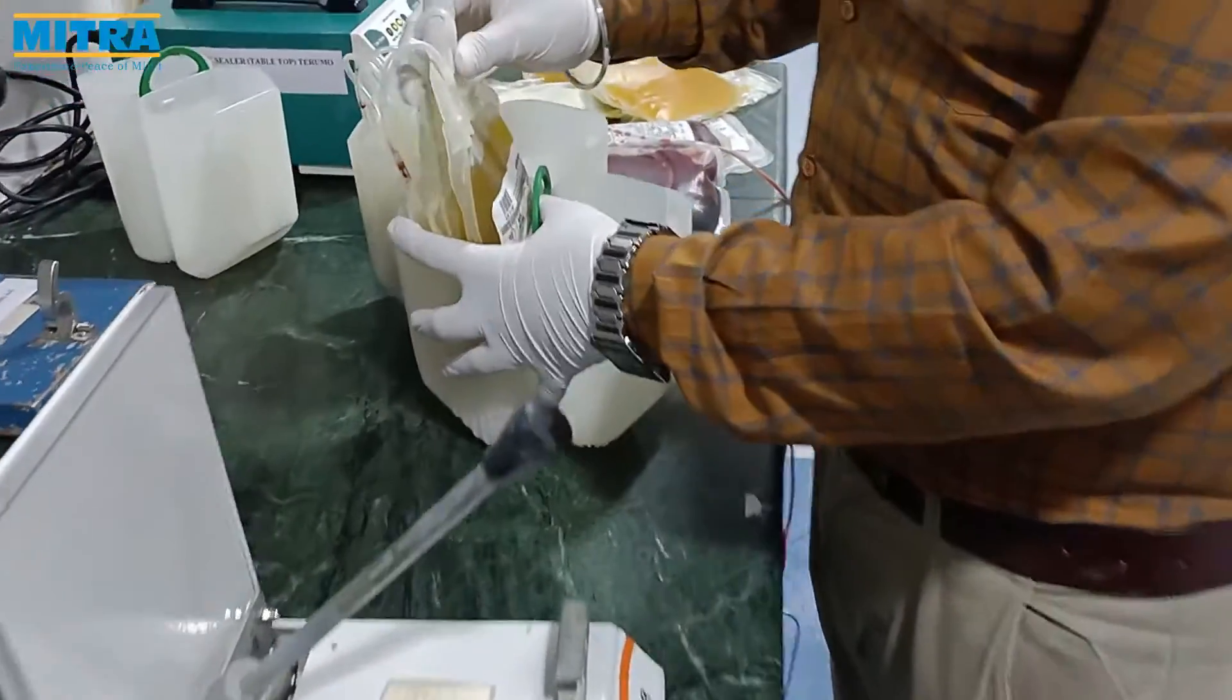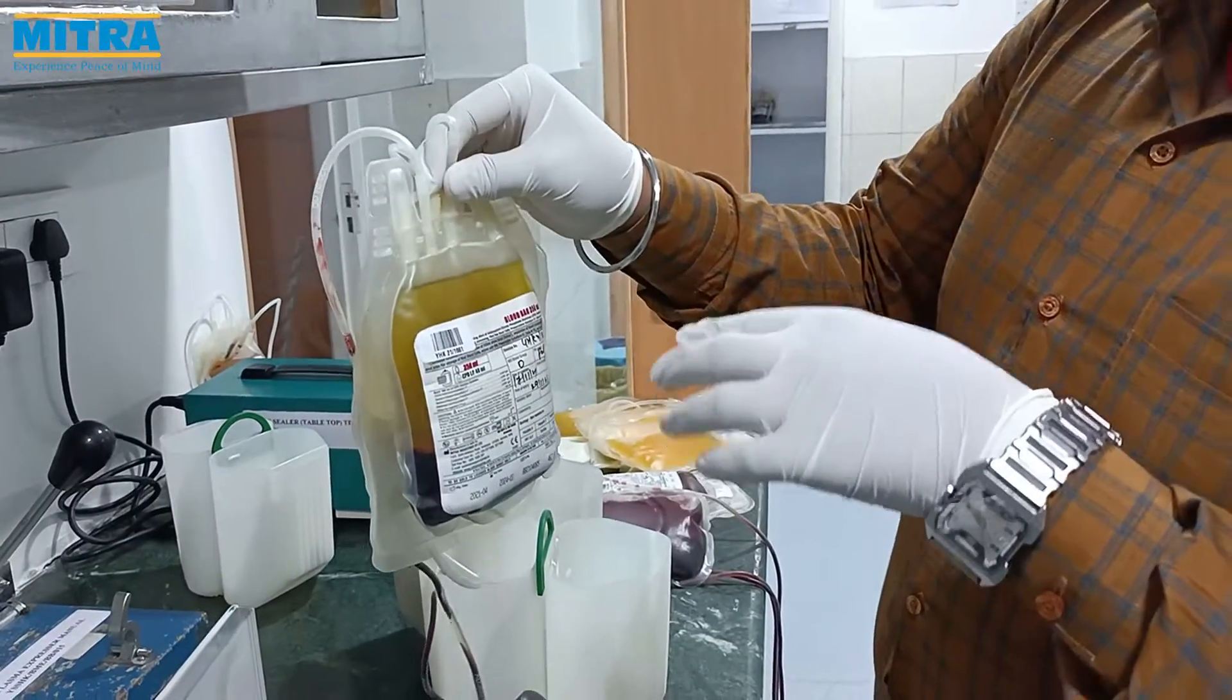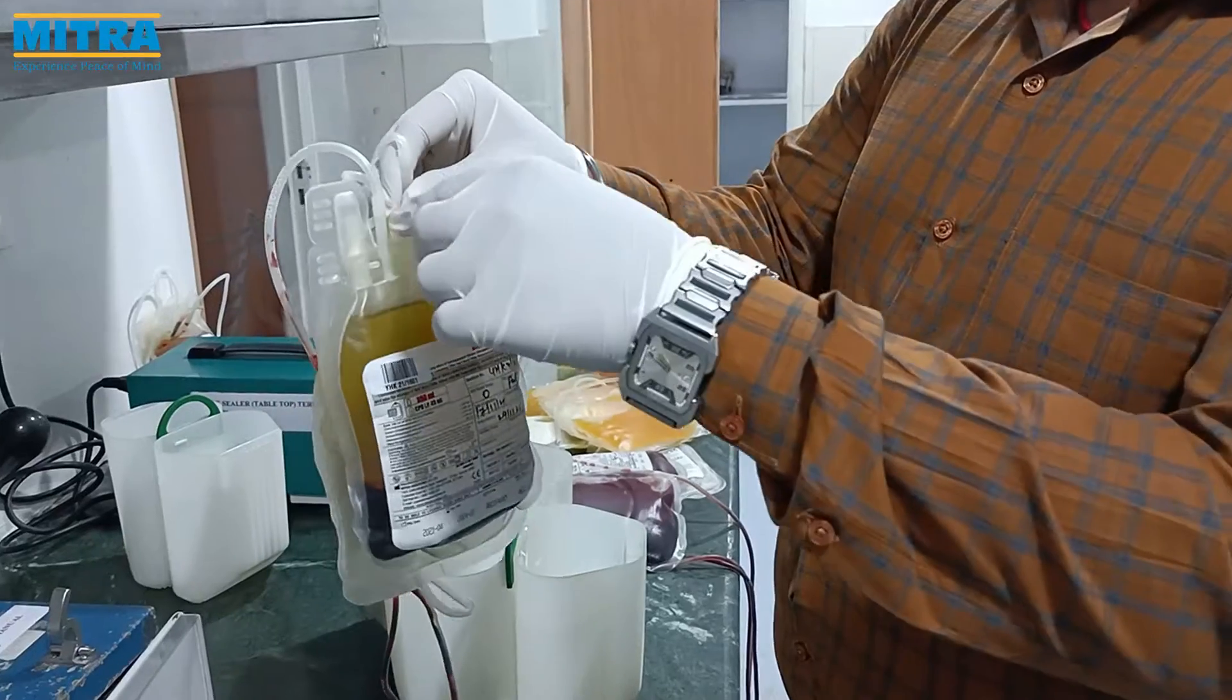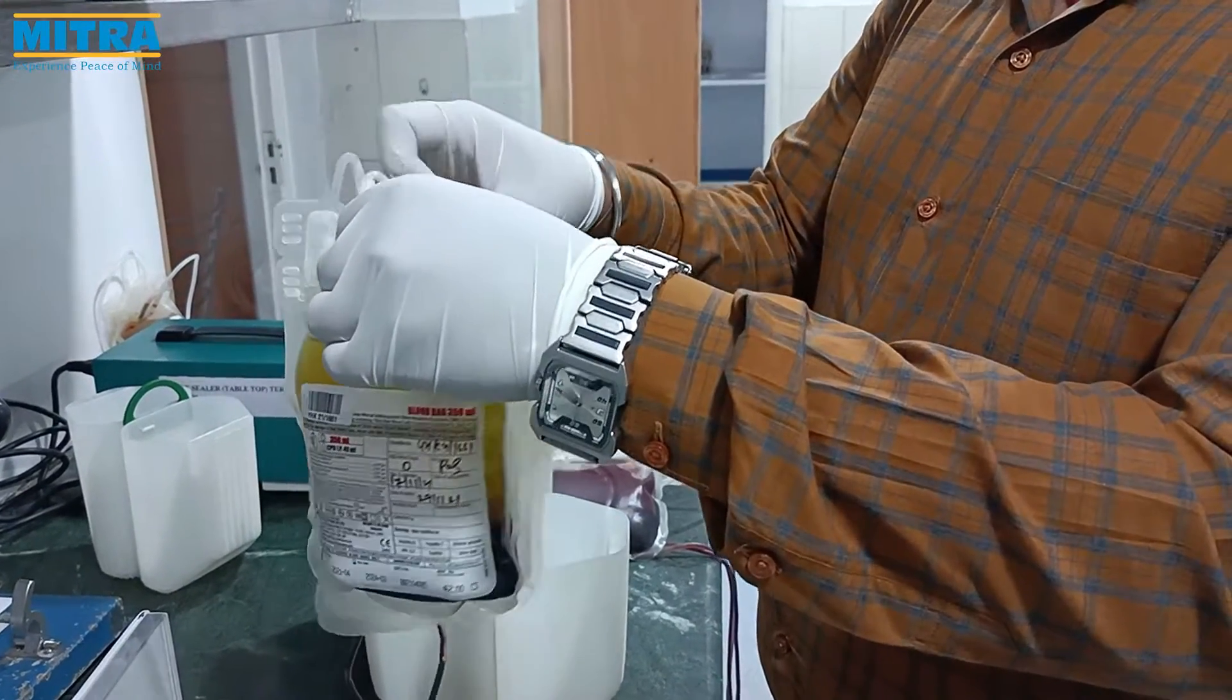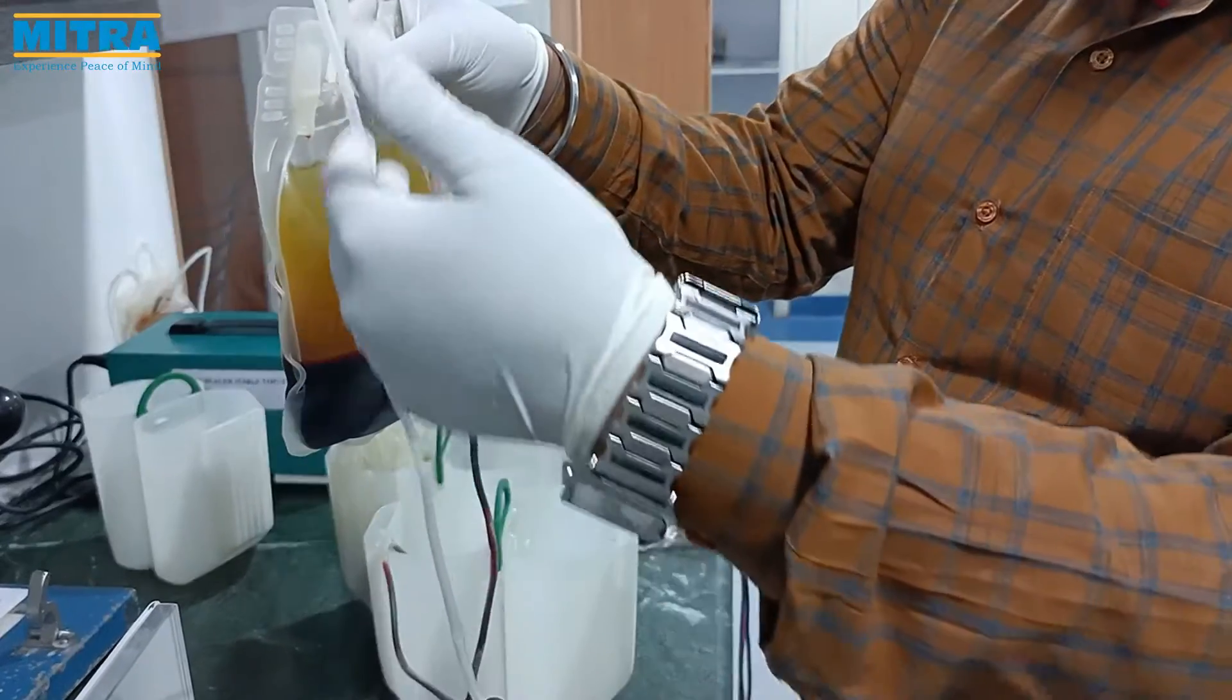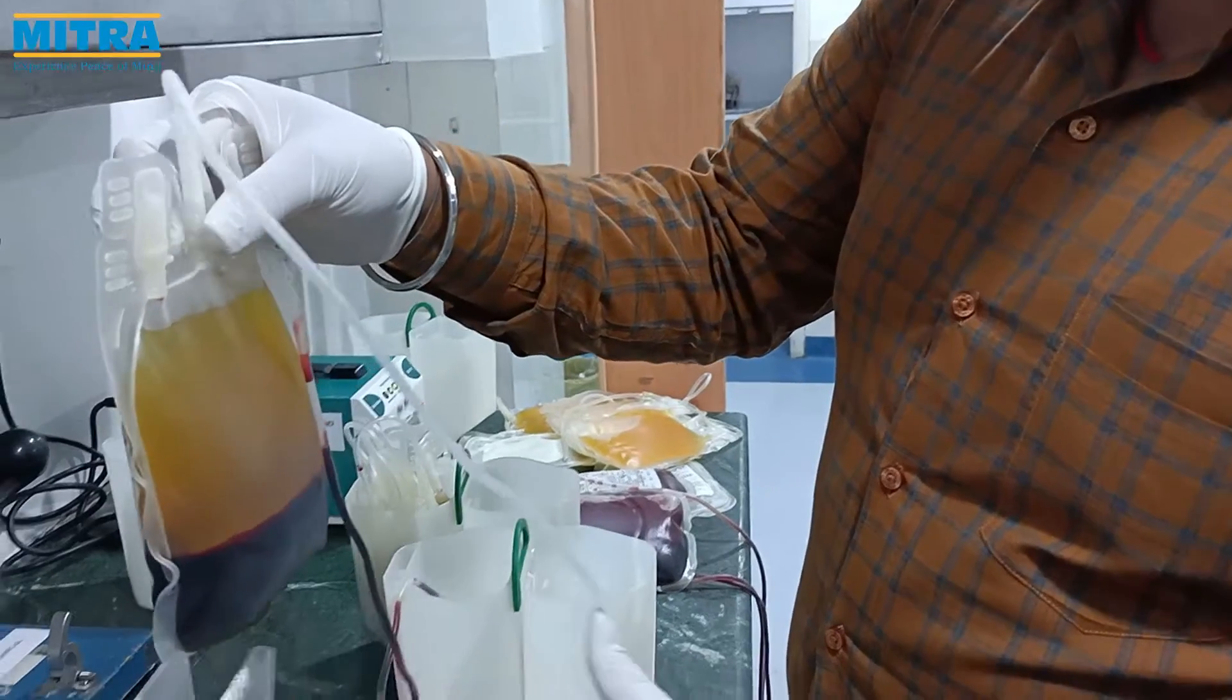Remove the blood bag from centrifuge buckets and check for sedimentation of RBC and contamination of RBC. If the sedimentation is good without any contamination of the RBC, place the blood bag into the manual separator equipment as shown in the video.